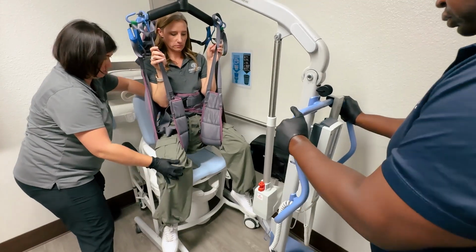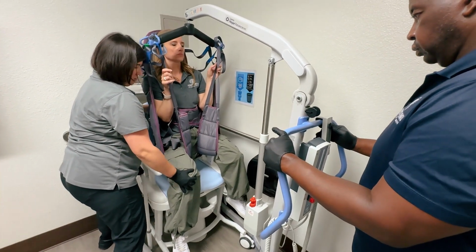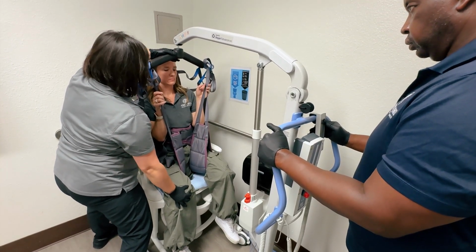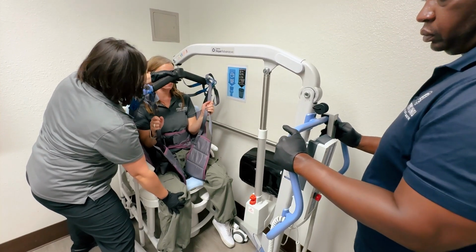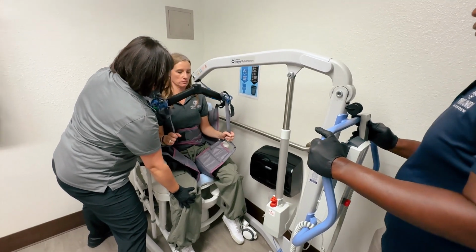Utilizing the remote, lower the student onto the toilet. Position the student to be centered and seated upright on the toilet. This can be achieved by pushing gently on the front of the student's knees to swing the student back over the commode and using the side grab handles to position the student in a more upright seated position.